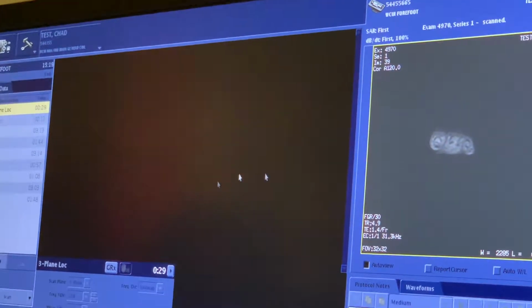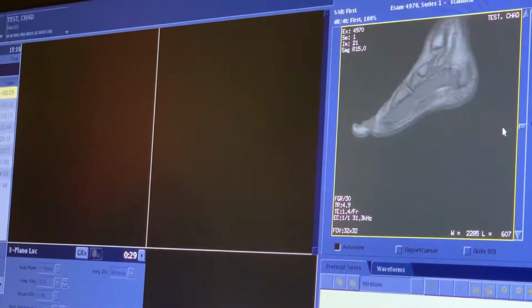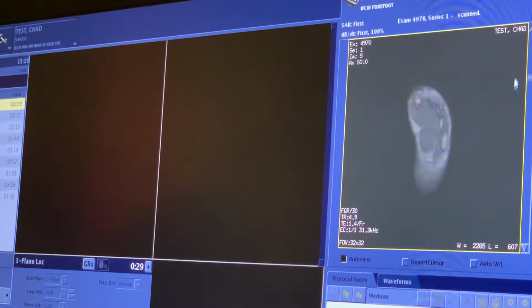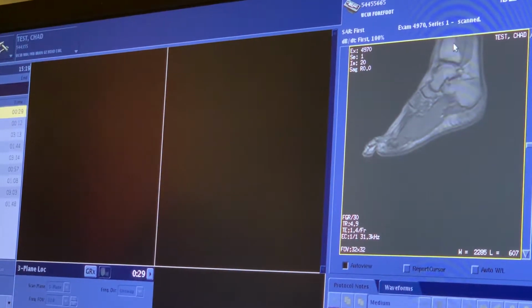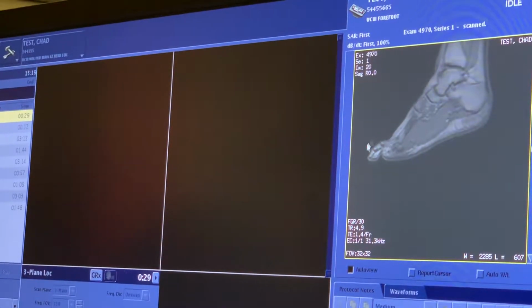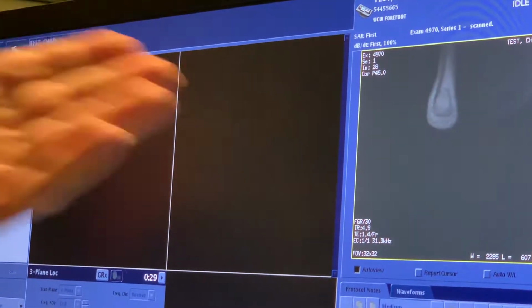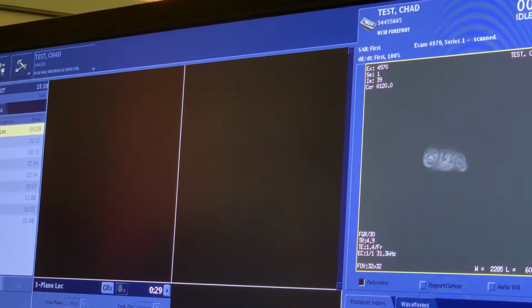All right, so on the Scout view, on the axial view, I want to have the toes. I want to have the heel. All right, so I've got both of those. The sagittal, I want to be able to see the whole foot, including the ankle joint. They refer to that as the mortise right there, the ankle joint, the toes, and the heel. And on the coronal view, I'd like to get as much of it as I can. I especially want to get to the toes or very close.